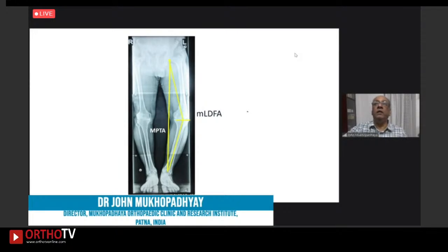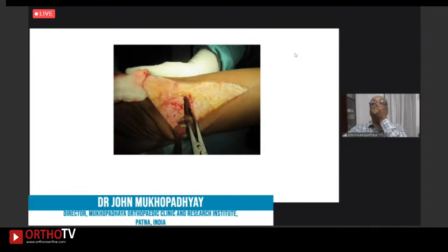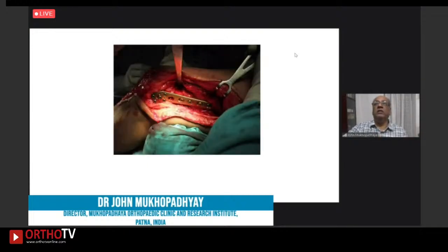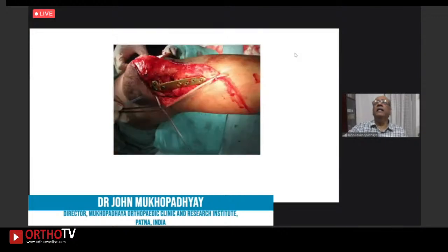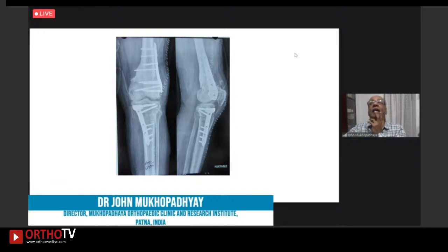A closing wedge lateral distal femur osteotomy was performed with a standard approach, along with a high tibial osteotomy using the Tomofix method with angle-stable implants — no bone graft even with quite a large correction on both sides. The femur received a closing wedge and the tibia an opening wedge osteotomy. Post-op shows good correction of overall alignment on both AP and lateral x-rays.